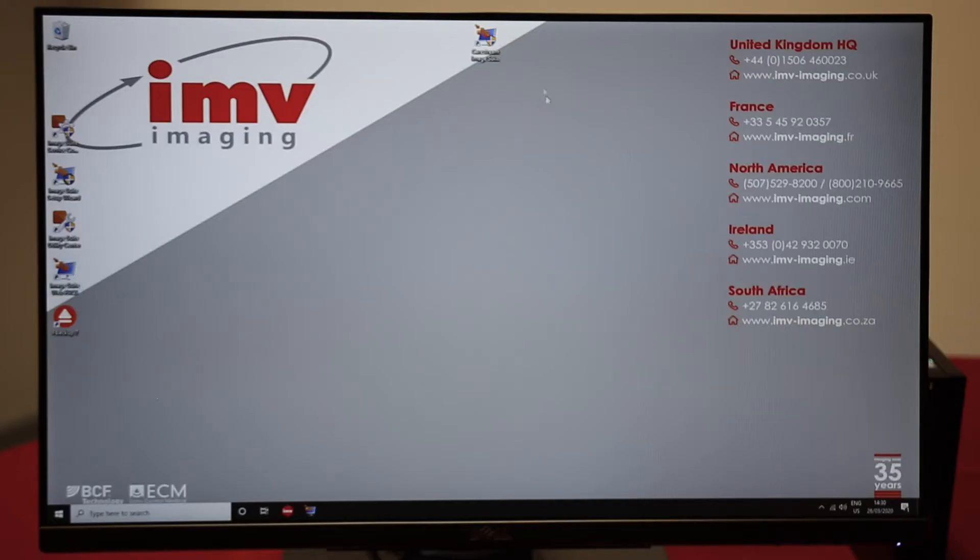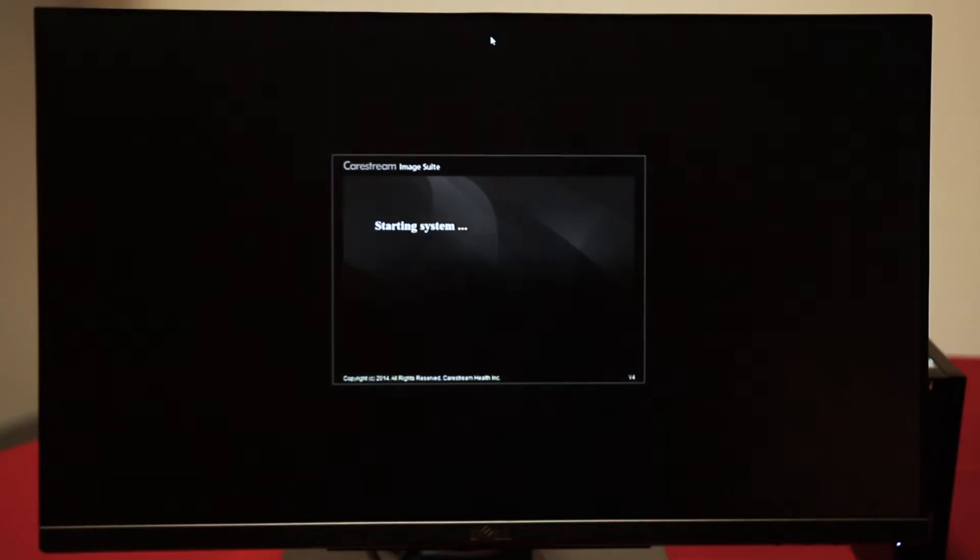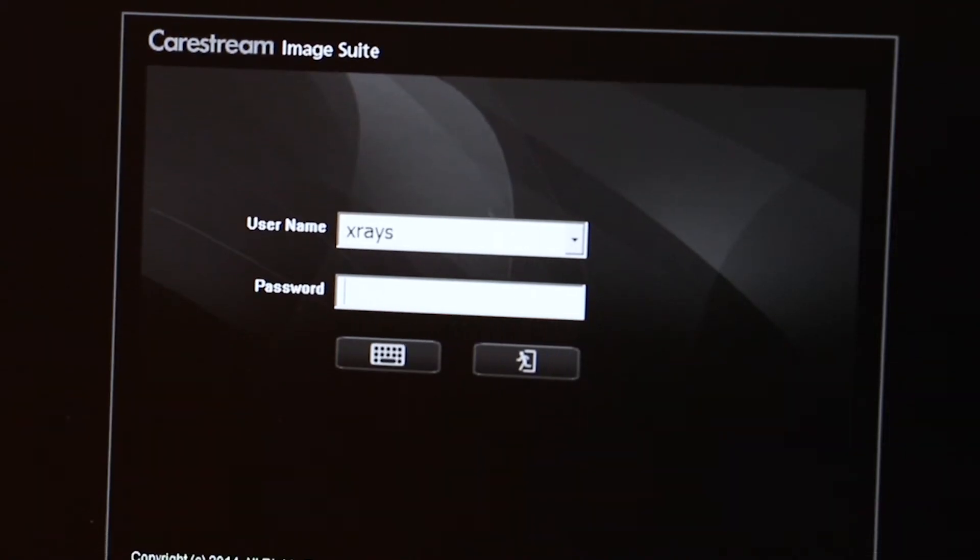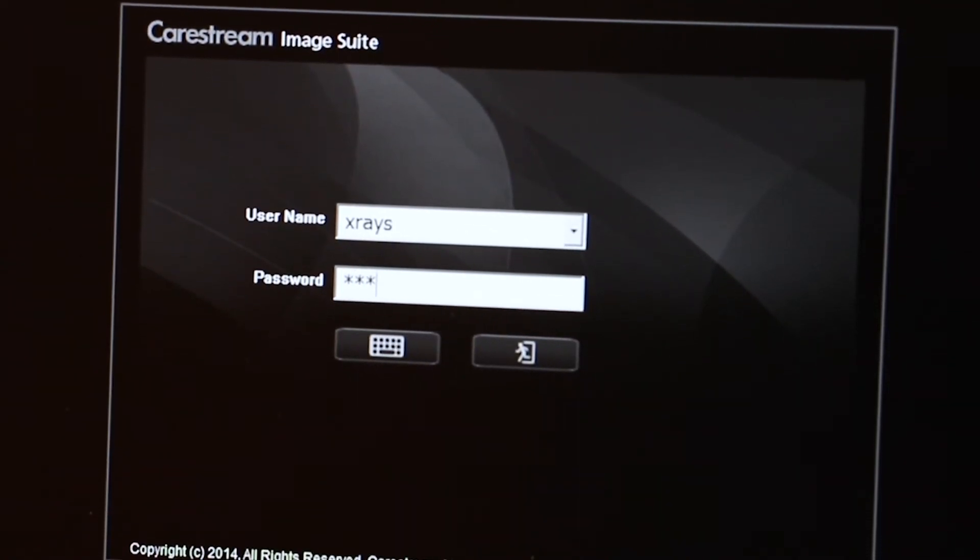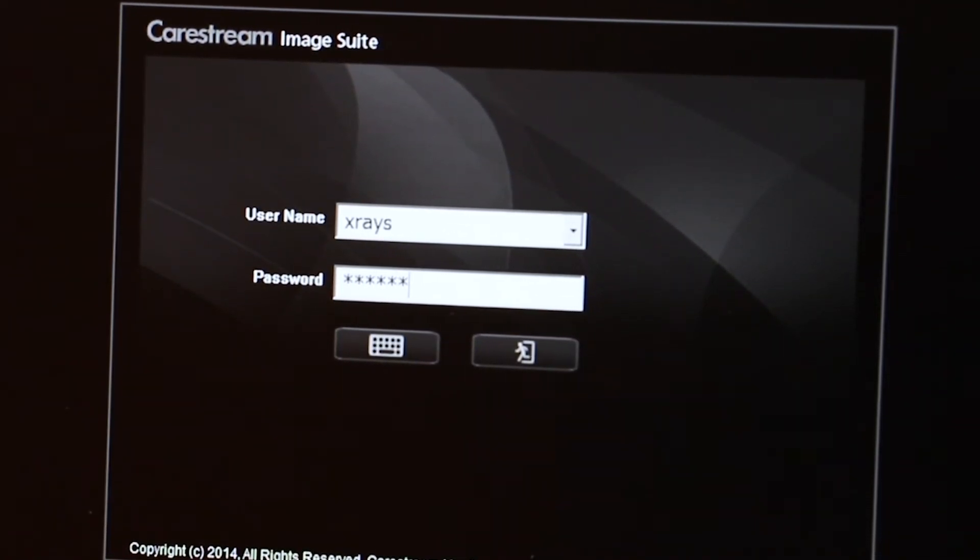To launch the software, double-click on the icon for CareStream ImageSuite. Login with the username xrays and the password 123456.